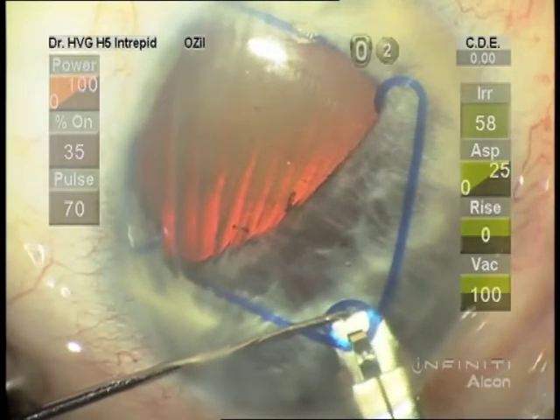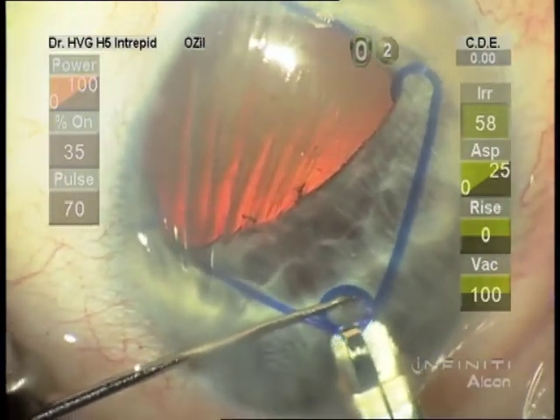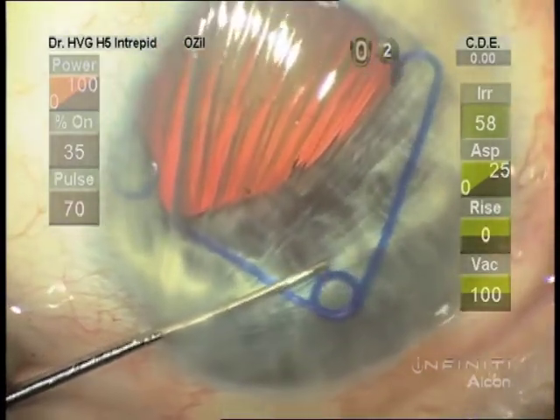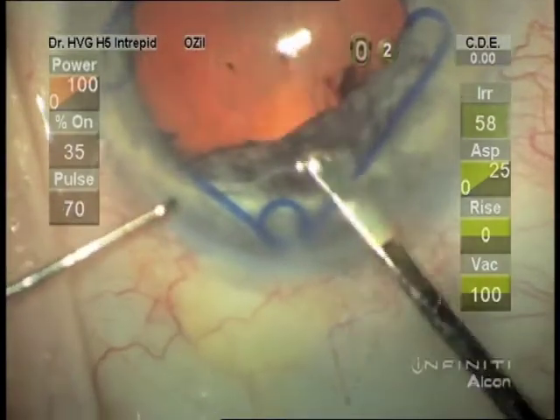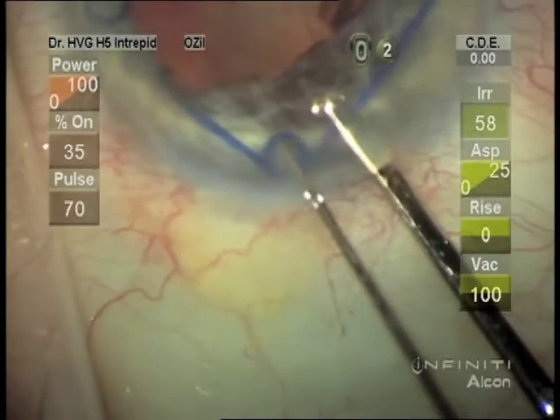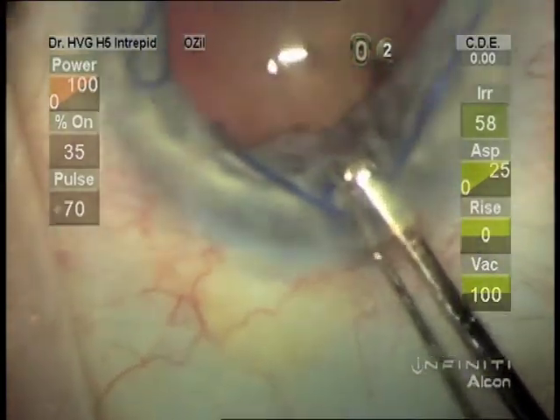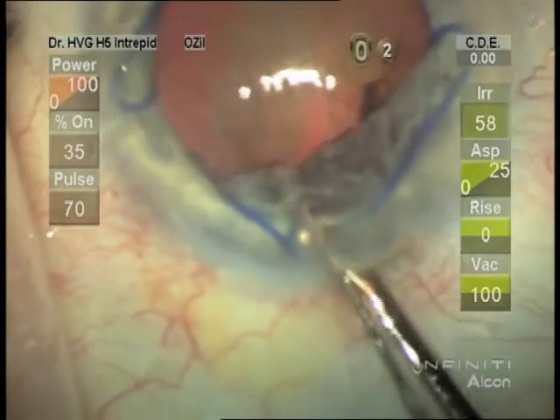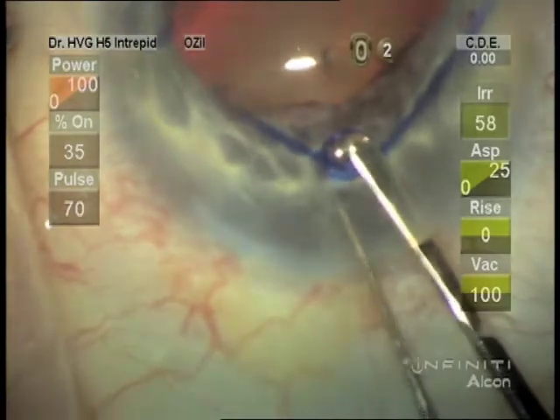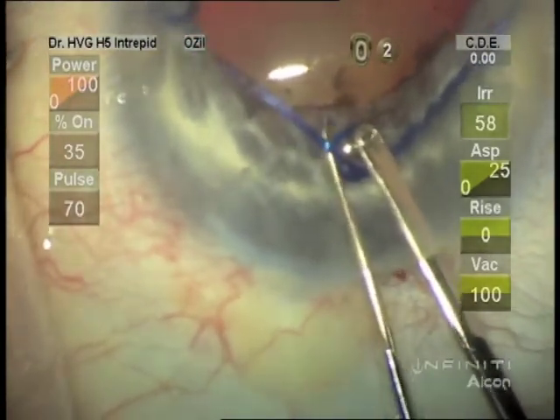I like the synechiae hook to release that last loop from the injector. And then with some type of a push-pull device, engaging the loop and then pulling the iris back with the synechiae hook.